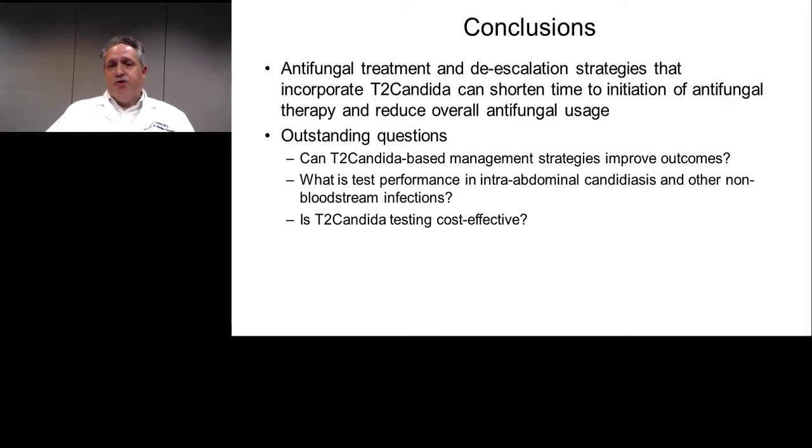Antifungal treatment and de-escalation strategies that incorporate T2 results can shorten time to initiation of antifungal therapy and can reduce overall antifungal usage. I think major questions right now that'll be answered as more clinical experience accrues is, can we use these management strategies not only to reduce antifungal usage or shorten the time to antifungal therapy, but can we actually impact patient outcomes and improve outcomes?